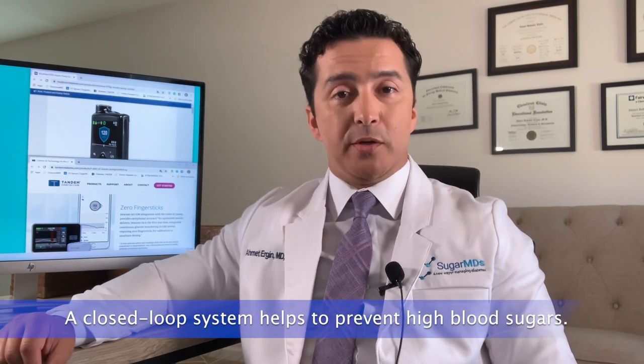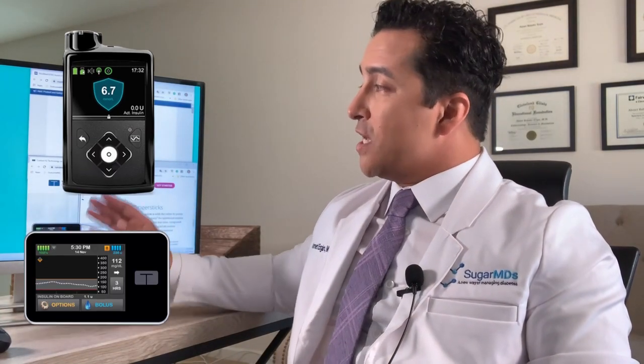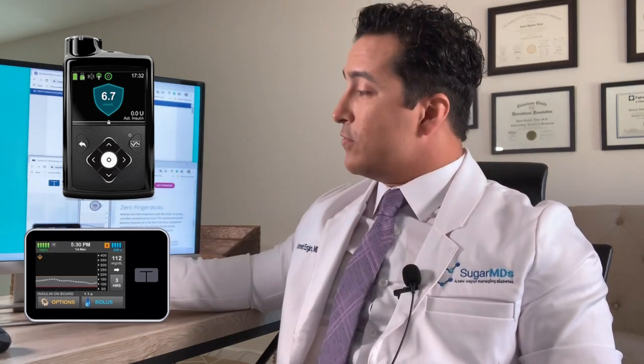Now we have closed loop systems that also help you prevent high blood sugars. Medtronic 670g and Tandem each have their own sensors — for Medtronic it is their proprietary sensor, and for Tandem they are partnering with Dexcom G6. Today we are going to summarize the important clinical features of these two pumps so you can make the best decision.